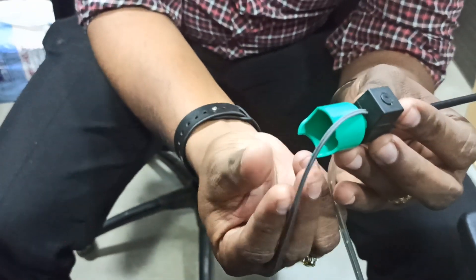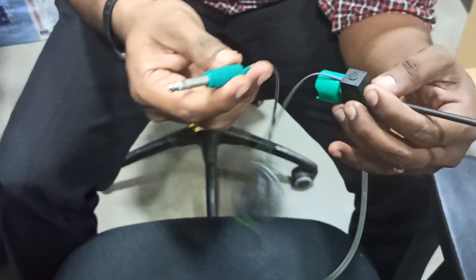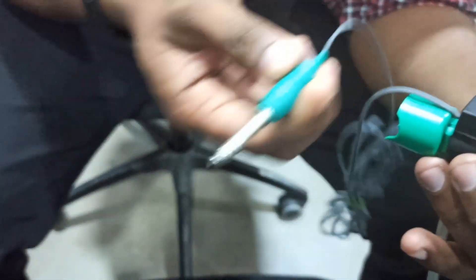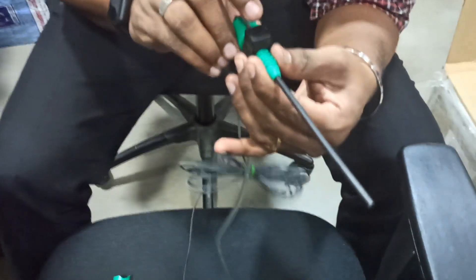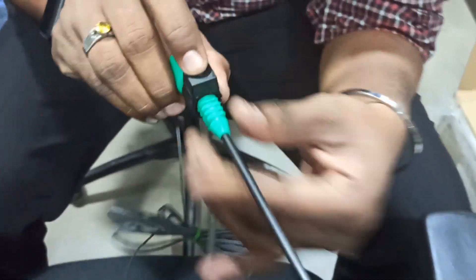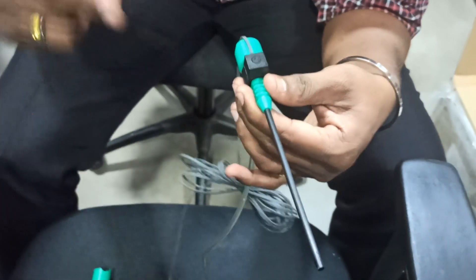Then connect the fiber optic cable down, and connect this end to the IPC endoscope port. Once you plug into the IPC endoscope port, whenever you press this button, irrigation will automatically come into the tip and the irrigation pump will run.